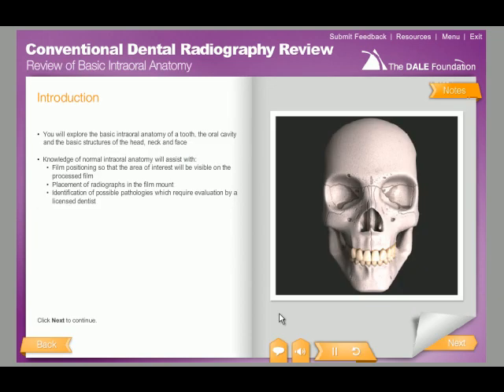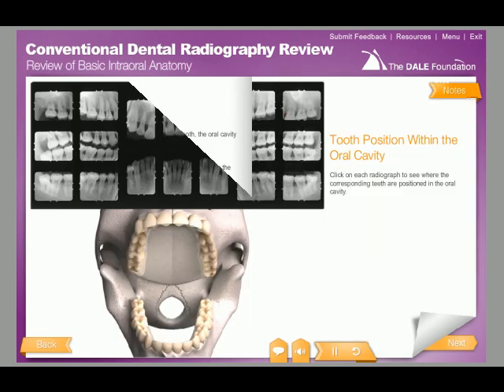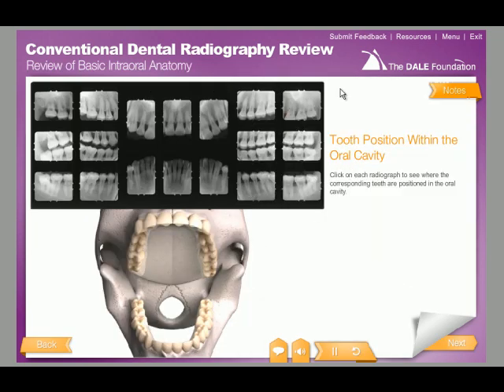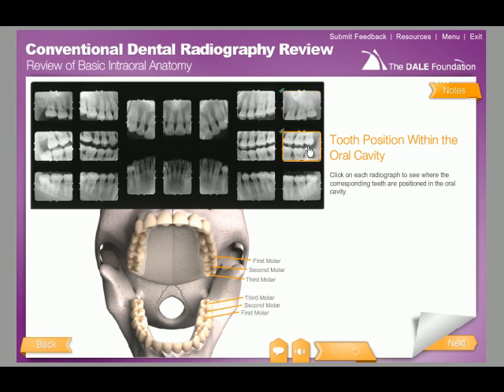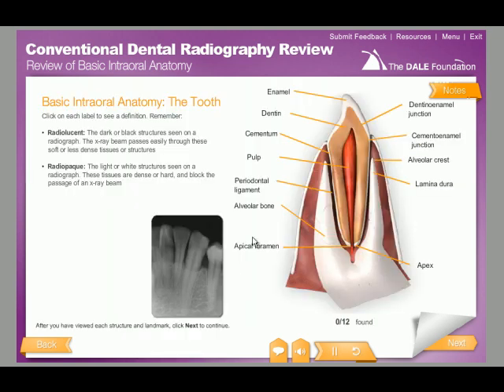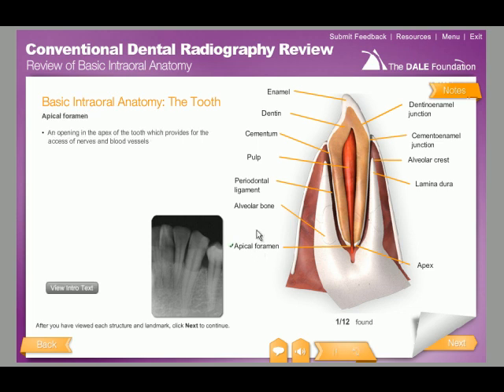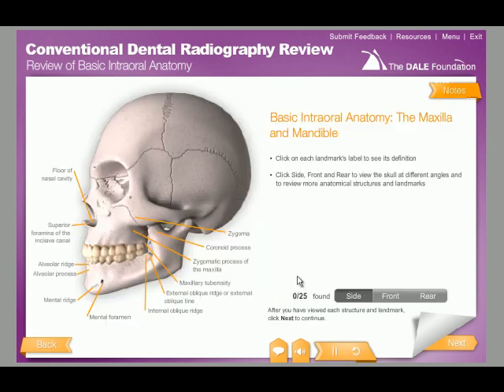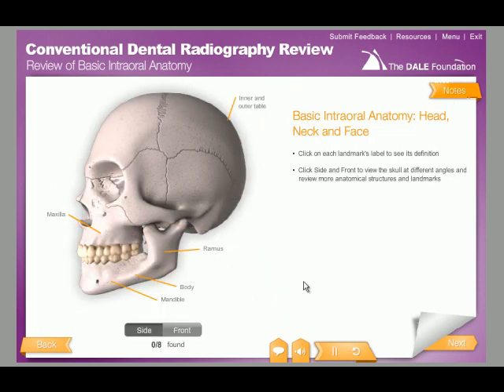The interactive e-learning course begins with a review of basic intraoral anatomy, where you can see the relation of teeth in the oral cavity to radiographs in a mount, and explore the basic intraoral anatomy of a tooth, the oral cavity, and the basic structures of the head, neck, and face.